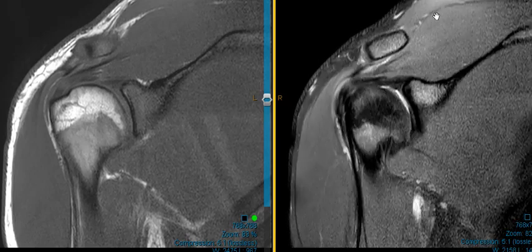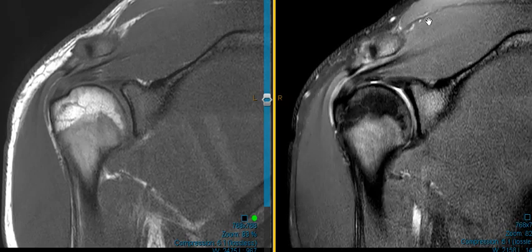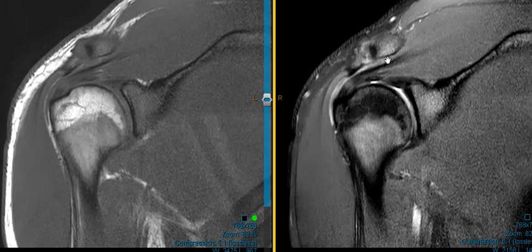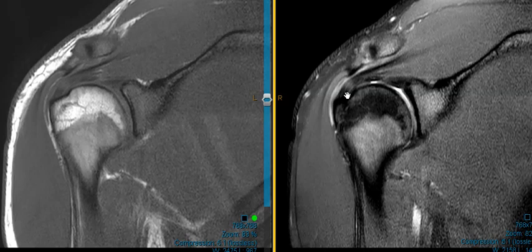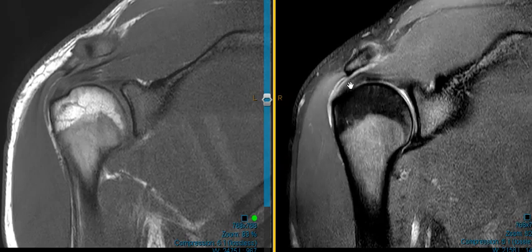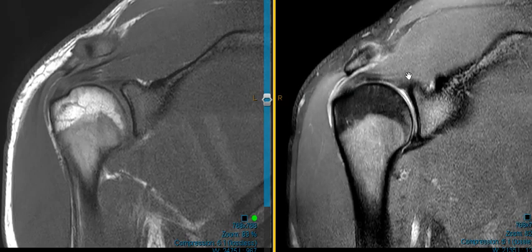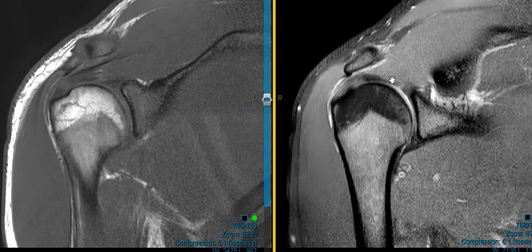In this patient they also have large muscles — they're a weightlifter or in very good shape. Here we have the supraspinatus muscle enlarged, and it's crowded as it tries to get down here between the clavicle, acromion, and the humeral head. Large muscles can sometimes cause impingement and lead to bursitis and inflammation of the rotator cuff itself. This is a case of tendinopathy and bursitis in a young athlete.